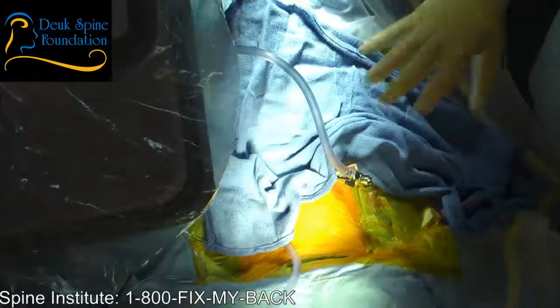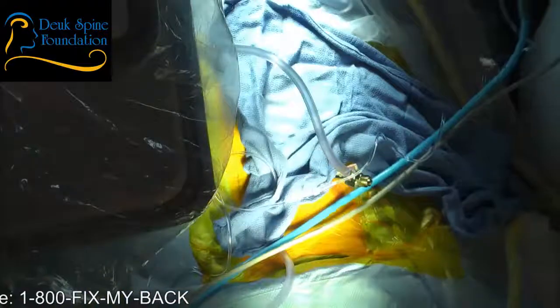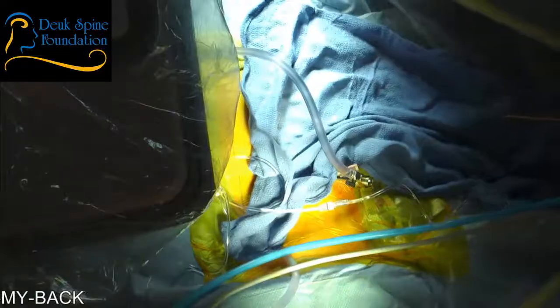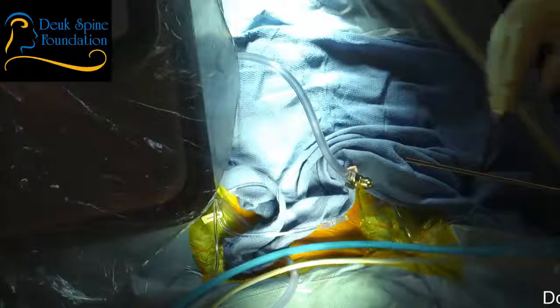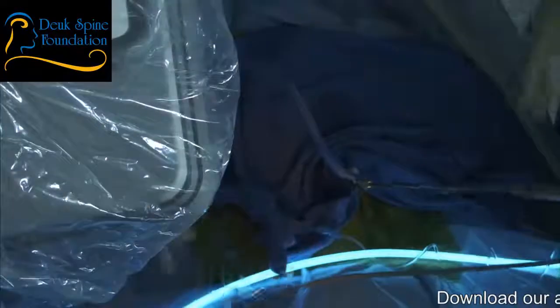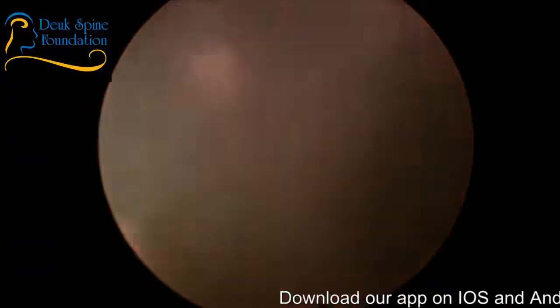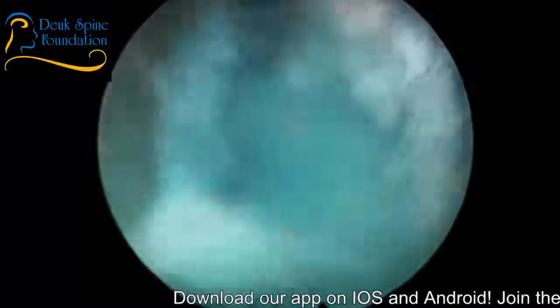Okay, we've got our fluid adapter on. We have our tube in. We have a pathway or portal for me to do the surgery on the disc. Now we're going to pass down that pathway or portal with the scope. And we're going to take a look at what's going on inside that disc. I already know what's going on based on the MRI. We're going to go in there and do our best to fix it.